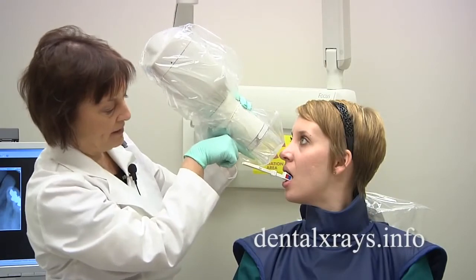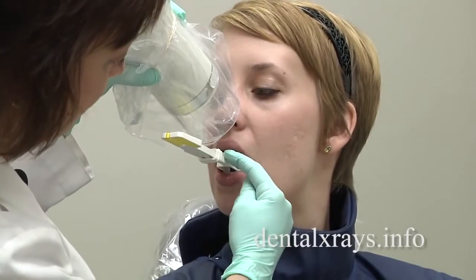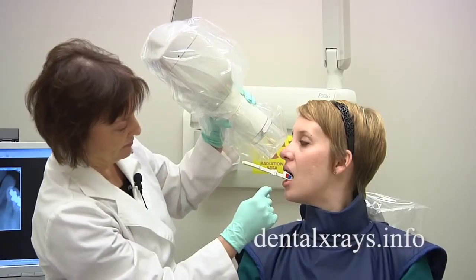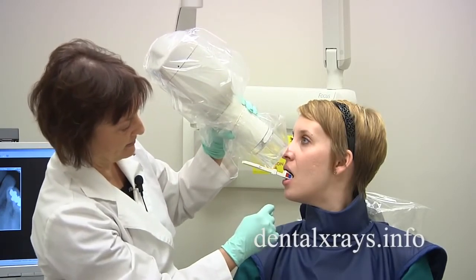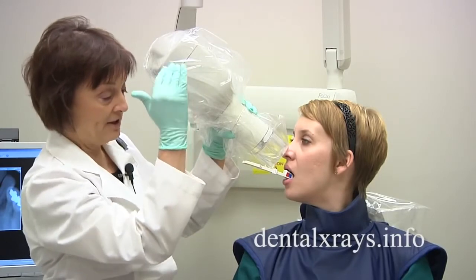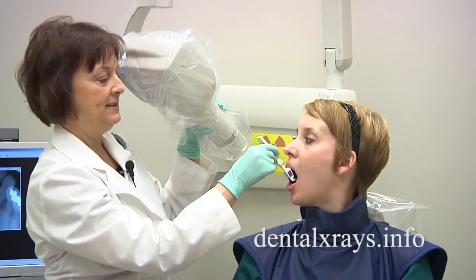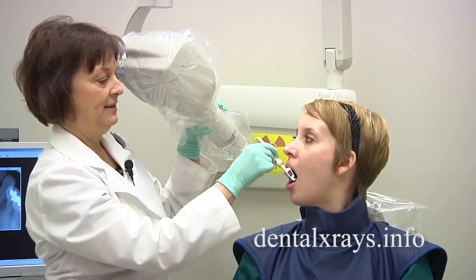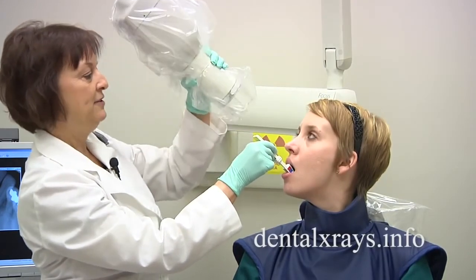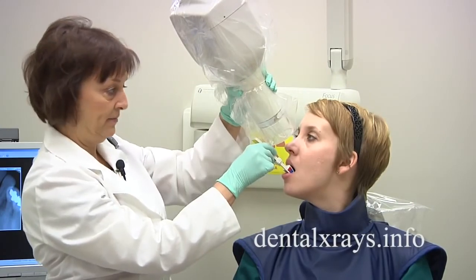I suggest the bottom edge of the cone is down far enough so that it's including the base of this piece right here — so this would be incorrect, this is more correct. Now some people have a shallow arch on top, so the whole film itself may be sitting flat instead of angled. So if it were to be like this, you can see that the vertical tube angle has to even be increased more to accommodate this type of mouth.